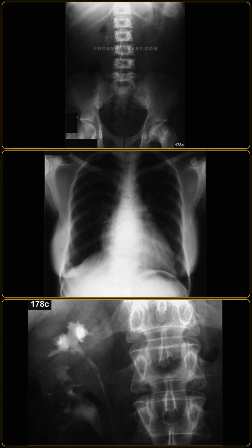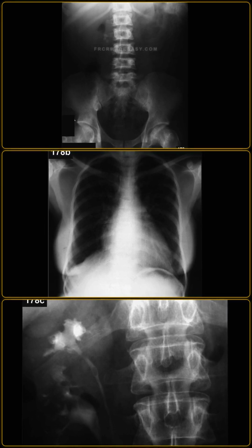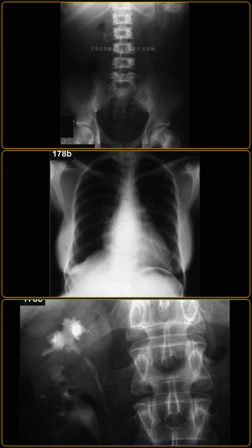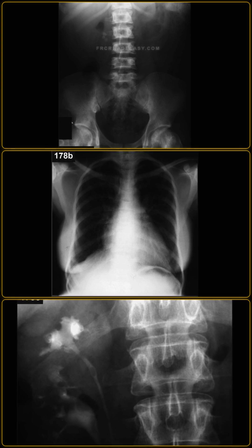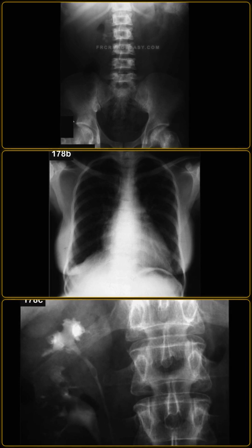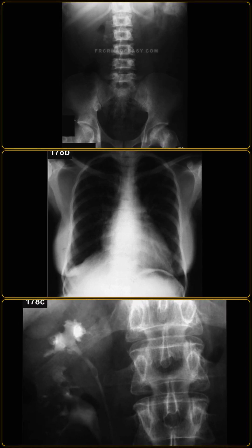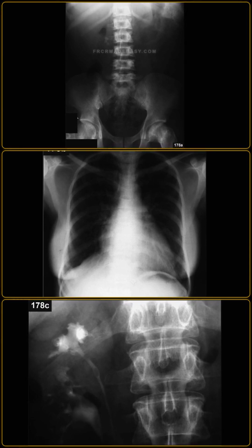If bone infection is clinically suspected, I would recommend a combined bone marrow and white blood cell scintigraphy or a dedicated spine and hip MRI to evaluate for osteomyelitis or joint effusion. Finally, I would document the findings, alert the referring clinician to the risk of renal papillary necrosis and autosplenectomy-associated sepsis, and refer the patient to hematology and orthopedic surgery for ongoing management.